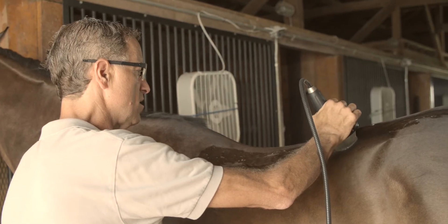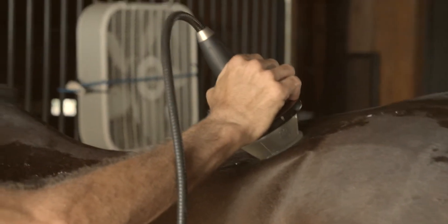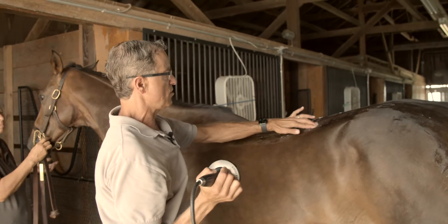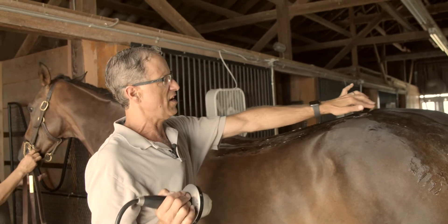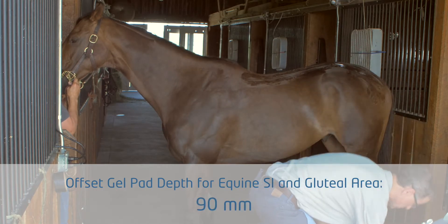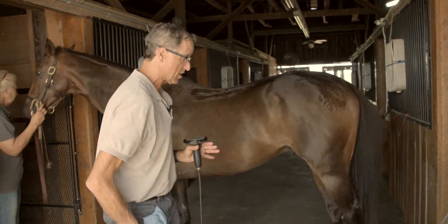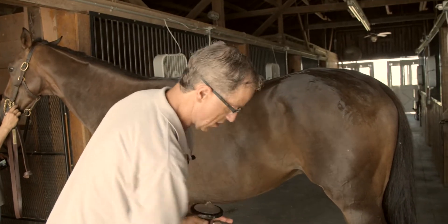Basically going along the typical meridian along the spine where horses typically get sore. Along here I use the 50 millimeter probe. Now when we get into the SI area and gluteal area, I'm going to switch offsets and go to a deeper probe. This is by far and away the most powerful system on the market for getting into these really important deep gluteal areas and SI areas.